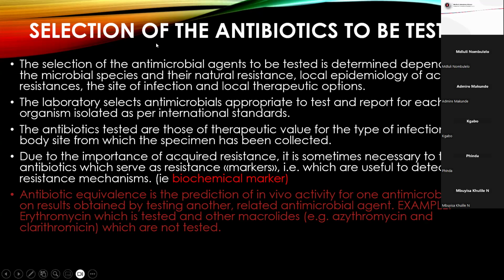Then also how you select or how you test the antibiotics is based on the methods which are used. Some methods don't allow this. I'll give an example. When you're doing Strep pneumoniae, because of the complexity of how it grows, it might not favor the MIC method, but it favors the disc method.